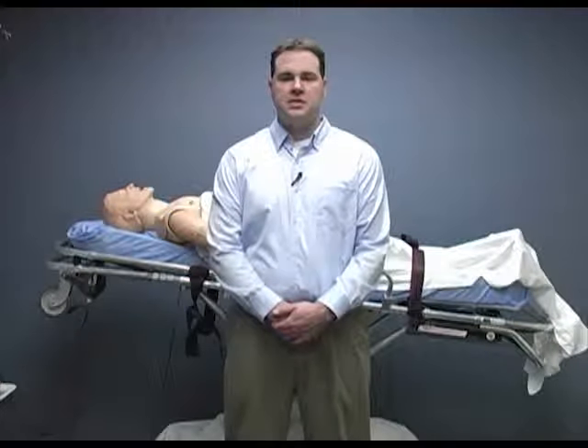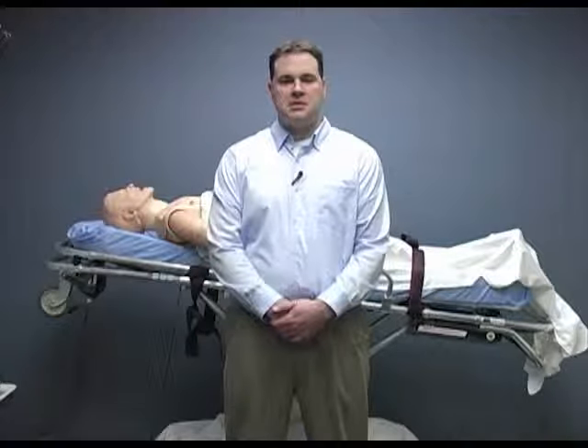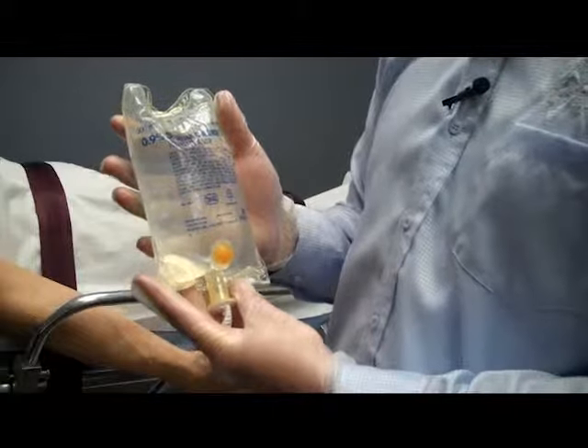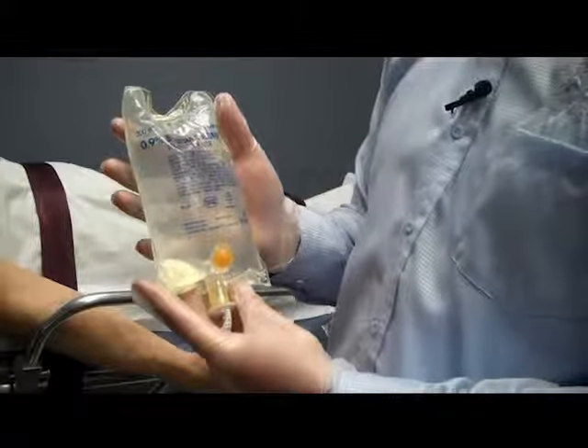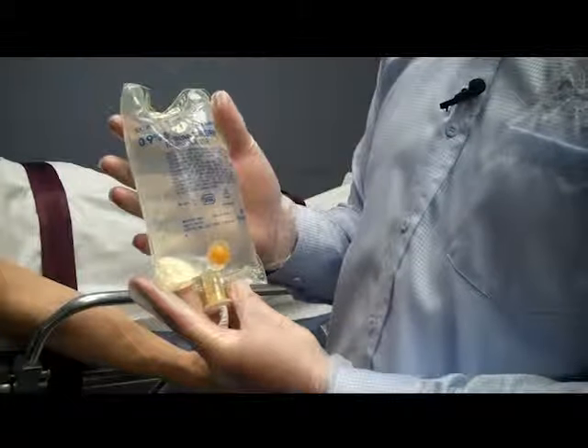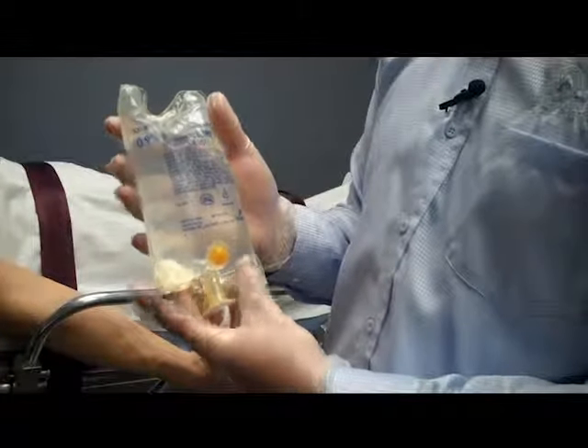First you need to explain the procedure to the patient. The next thing we are going to do is check our equipment and material. You are going to make sure you have the proper fluid, it is not expired, and there are no punctures, tears, or leaks in the bag. Finally make sure the fluid is clear with nothing floating in it and it is not discolored.